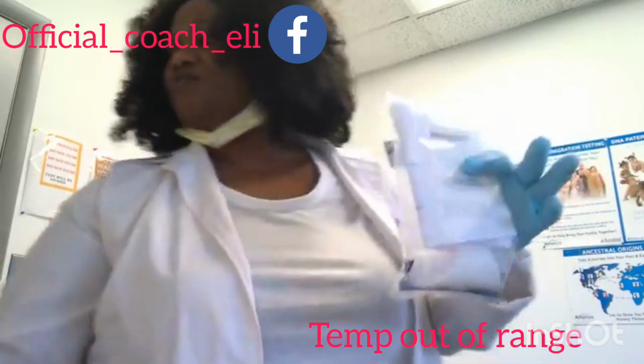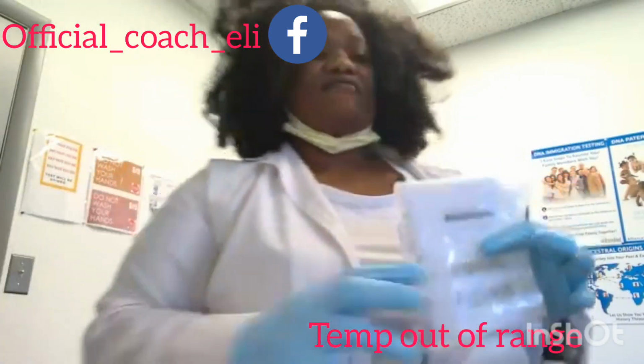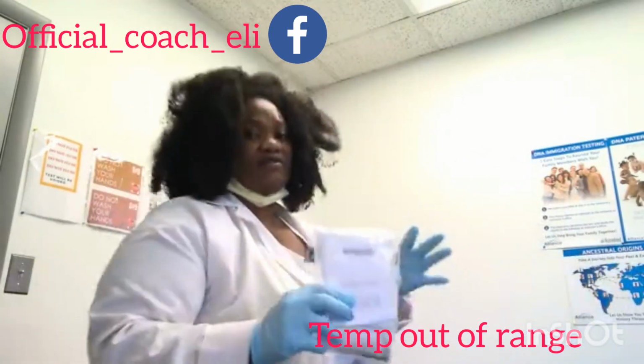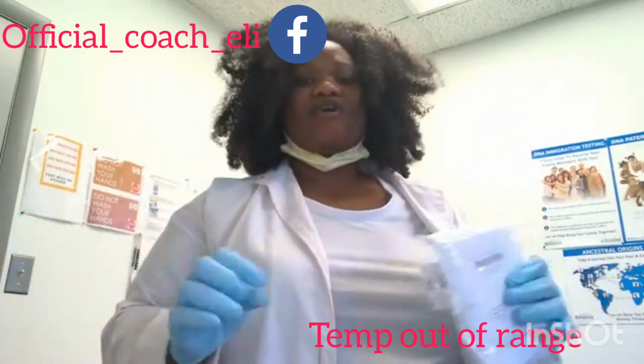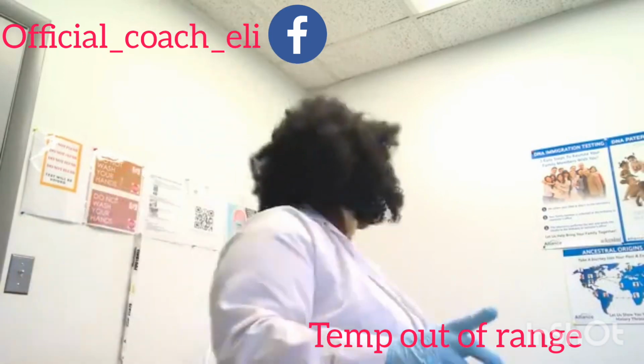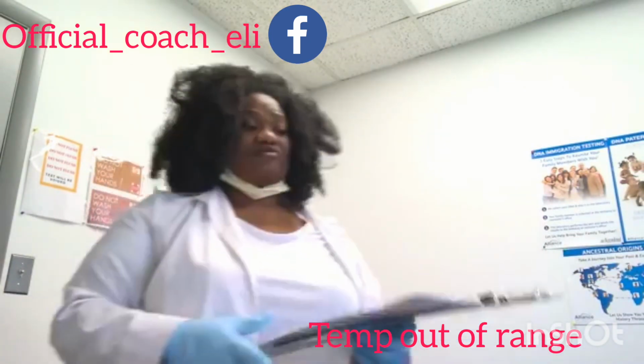And that means we have 2 tests, right? 2 tests all in together. 1 of 2 and 2 of 2. Guys, that's how you do your specimen collection for temp out of range and direct observation.